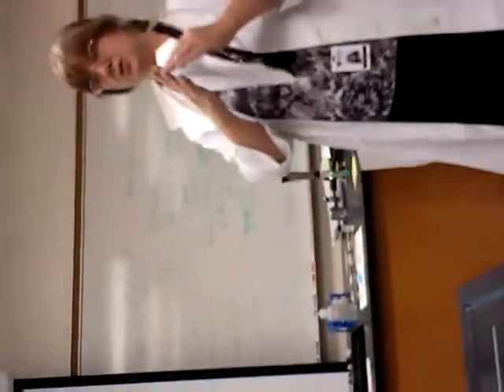The body reacts to the corresponding antigen and gets agglutination. A tiny little granular appearance, not a color change, a tiny granular appearance down the fluid in black spots. What was the organism? Proteus. What does Proteus cross-react with? Rickettsia, which in this case is Rickettsia for what? Typhus. Okay, how does that relate to World War II?